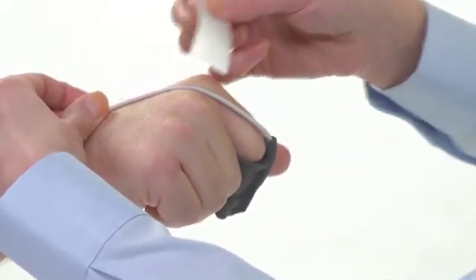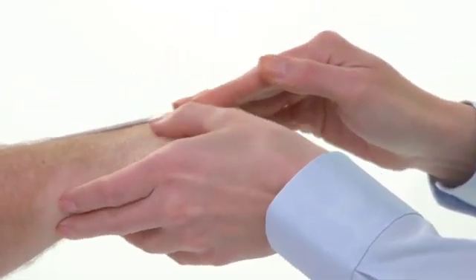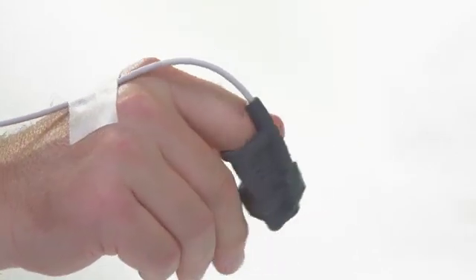For extended use, it's a good idea to secure the cable with medical tape on the top of the hand with a little slack for movement. This helps prevent pulling at the sensor site.